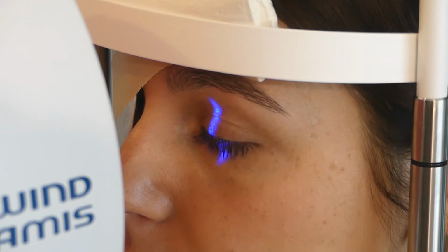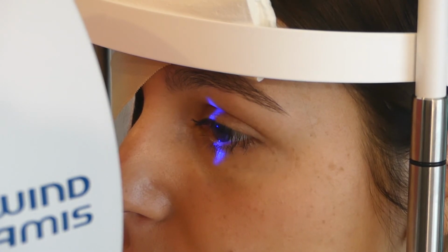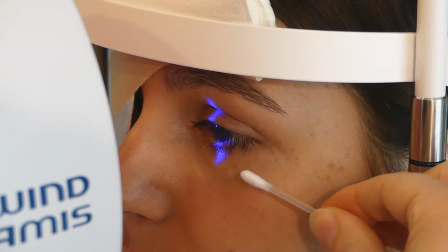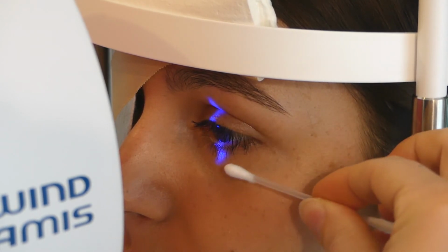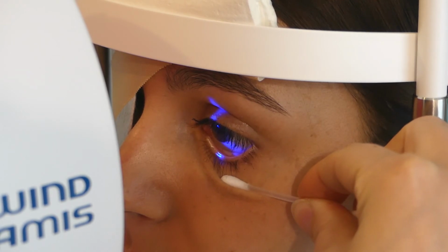In case the patient is not able to open the eye as wide as possible by him or herself, you should open the eye manually. And therefore you should use something like a cotton stick, and then, depending on if the upper or lower eyelid is covering the cornea. Let's start with the lower eyelid. If it's covering the cornea, you pull it down like this without touching the eyeball.